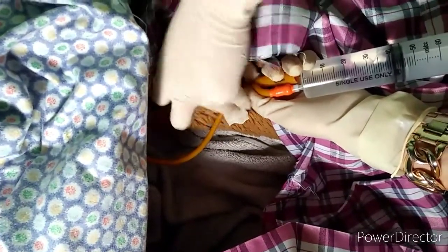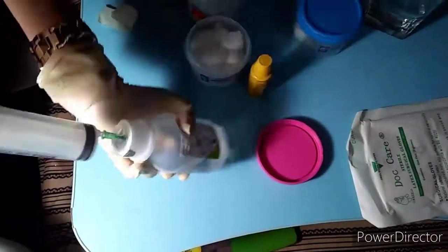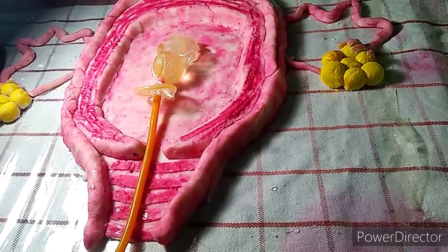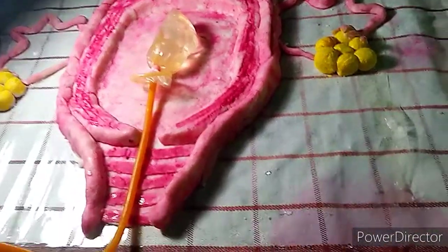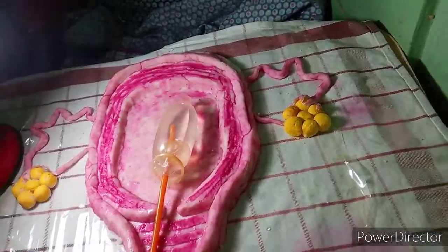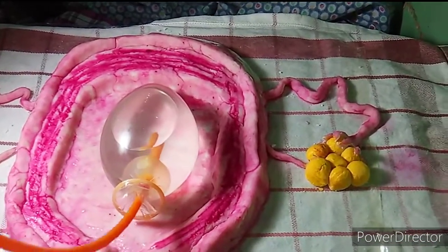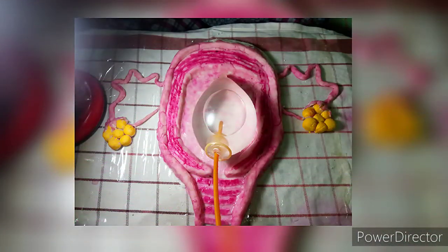Tape the catheter to the patient's thigh for gentle traction. Draw another 50 ml of NSS and attach it in a one-way valve of the catheter. Push NSS into the main condom balloon inside the uterus. As the balloon fills with water, it inflates. Repeat this action using as much water as necessary to stop the bleeding. This usually requires 300 to 500 milliliters of NSS. This pressure stops the bleeding.